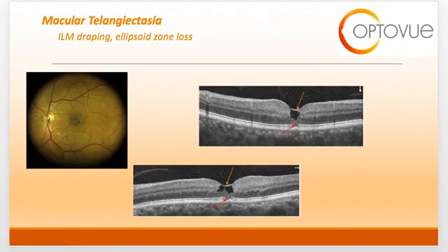Often, only the internal limiting membrane is left in place over these areas, lending to the term ILM drape. The orange arrows on this slide are directed at the areas of ILM draping. You can also see loss of the ellipsoid zone as indicated by the red arrows on this slide.